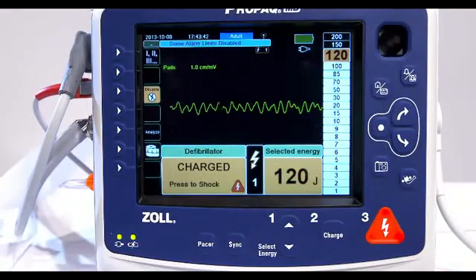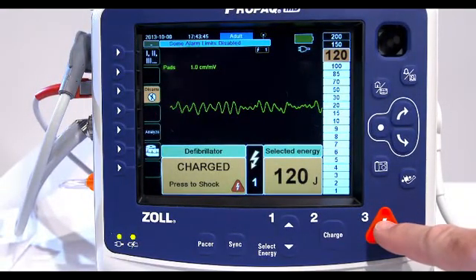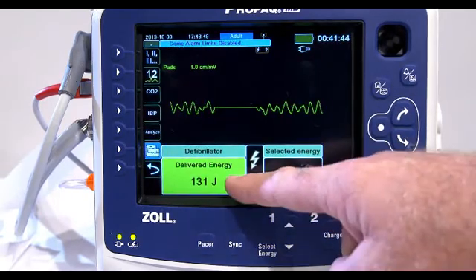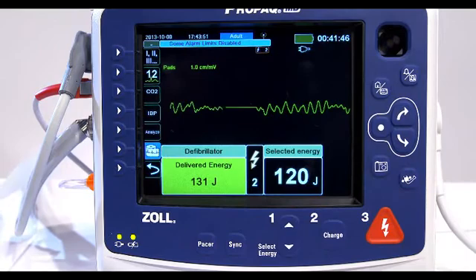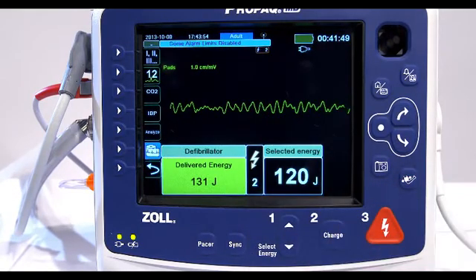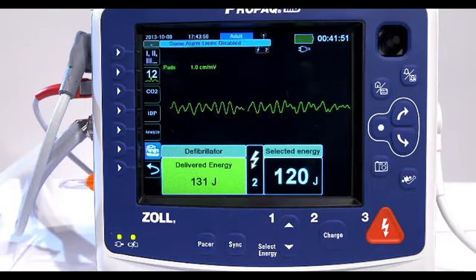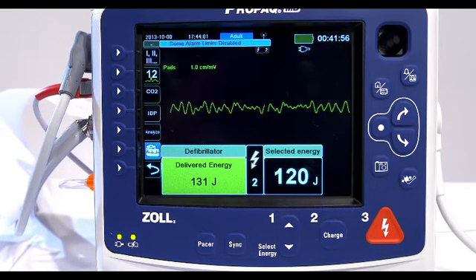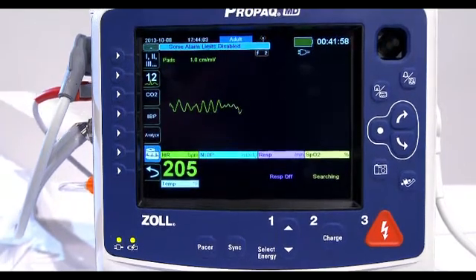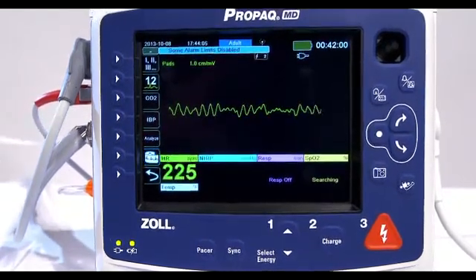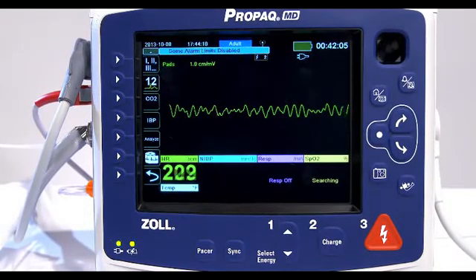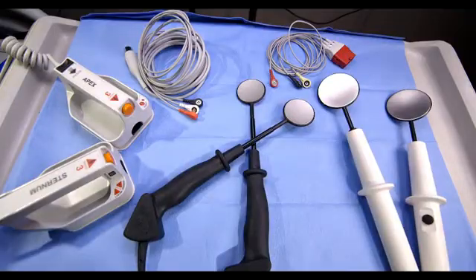Press and hold the shock button on the front panel until energy is delivered to the patient. The delivered energy level is displayed at the bottom of the screen and the shock number displays at the top of the screen and in the defib control panel. Begin compressions immediately after you have delivered the shock. After 2 minutes of compressions, analyze the rhythm. Repeat this sequence until the end of the resuscitation event.